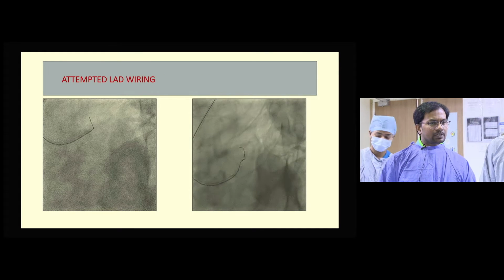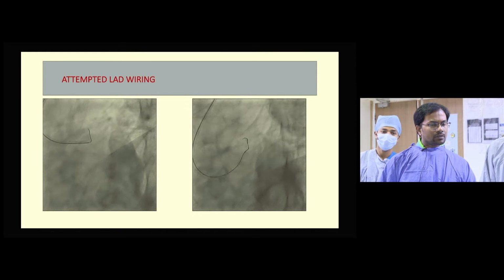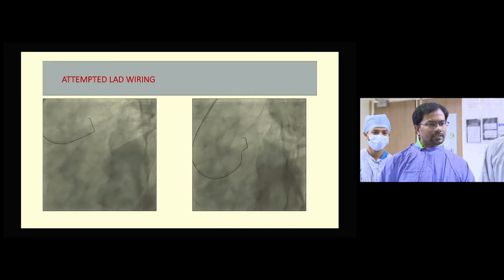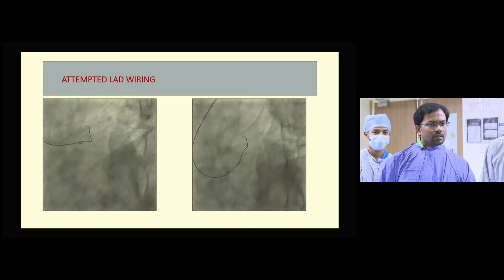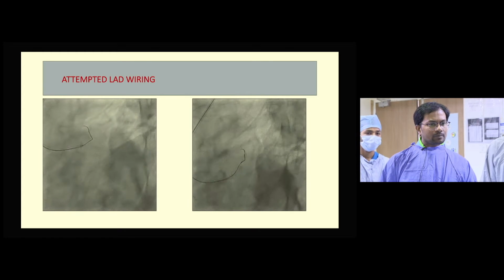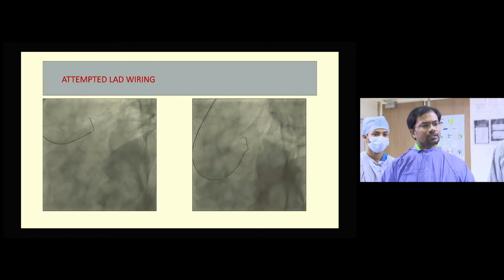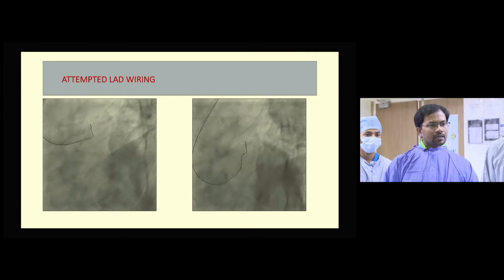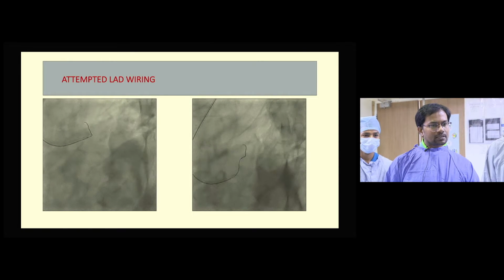And we attempted LAD wiring. It was not successful, it went into subintimal space. So we abandoned at this moment in view of culprit vessel PTCA. After one day we discharged the patient, and we asked for a second intervention after 2 weeks. He came for the second intervention, and today we are attempting this LAD PTCA.